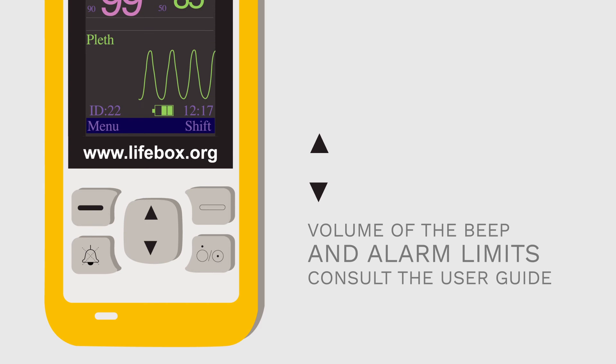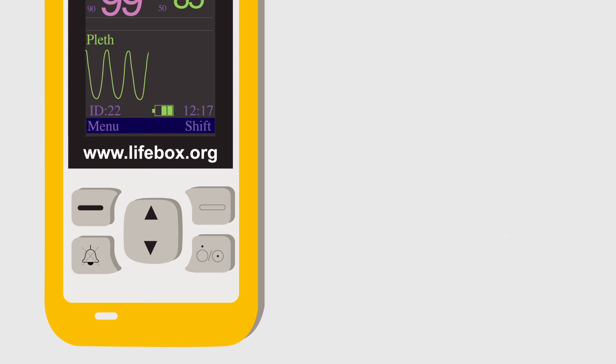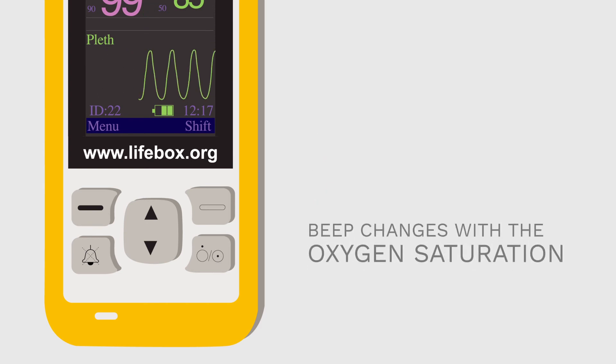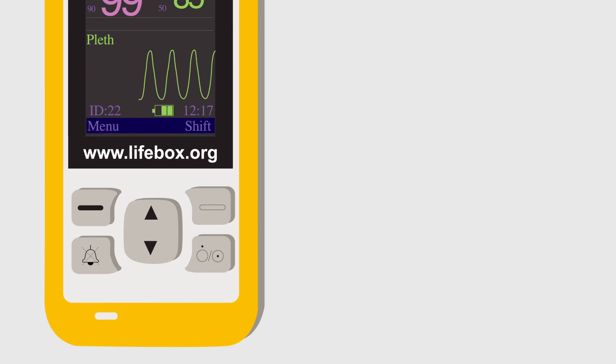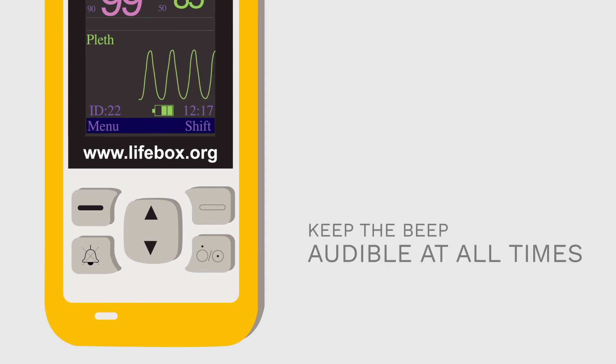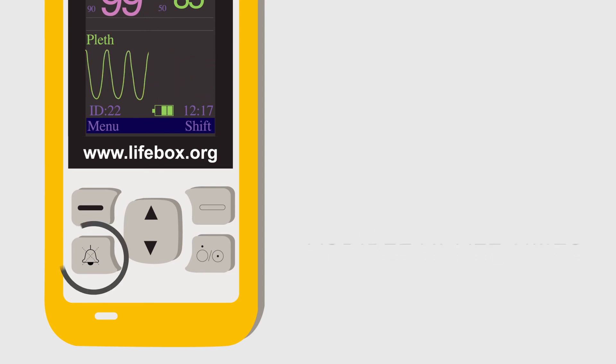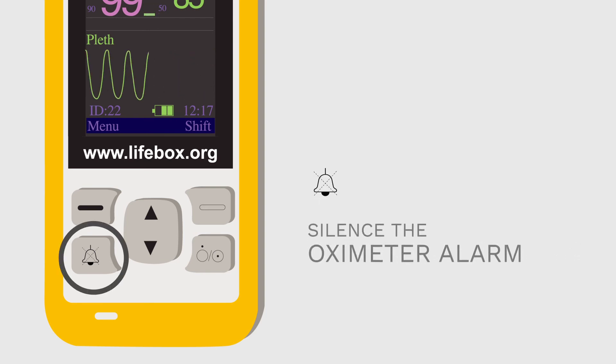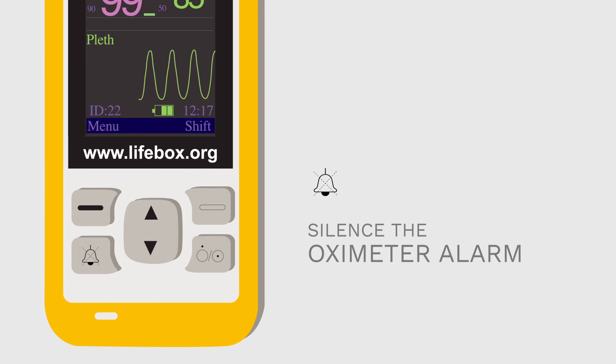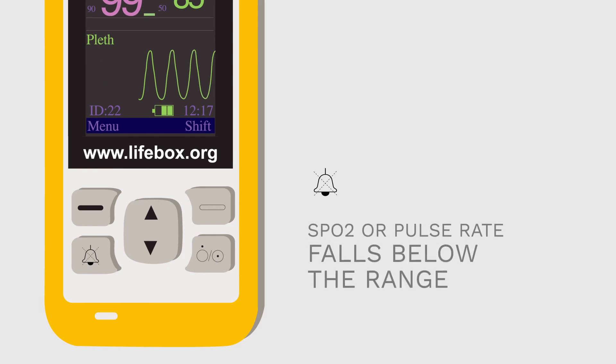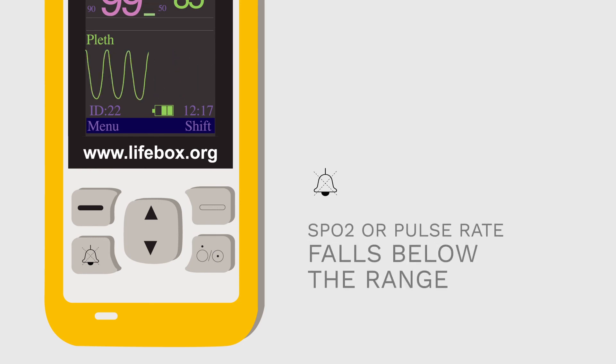The beep of the oximeter changes with the oxygen saturation. This is a second set of eyes and ears and we recommend that you keep the beep of the oximeter audible at all times. Below the menu is a button that can silence the oximeter alarm but only for 120 seconds. The alarm goes off whenever the SpO2 or pulse rate falls below the range you have set, unless the device has been silenced.